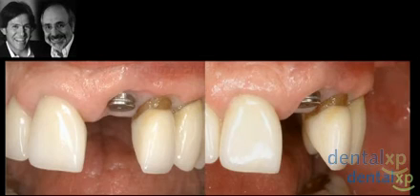So we're going to go ahead in this case, and the implant was placed by another dentist and sent to our office. The patient was quite upset. Obviously recession on the facial aspect, but even more dramatically on the lateral incisor now, on a tooth that they had no intention of restoring. This is a patient that already was upset that they were losing the left central incisor. Now they're concerned about what they're going to do about the left lateral incisor, and we have also even lost more of the interdental papilla.